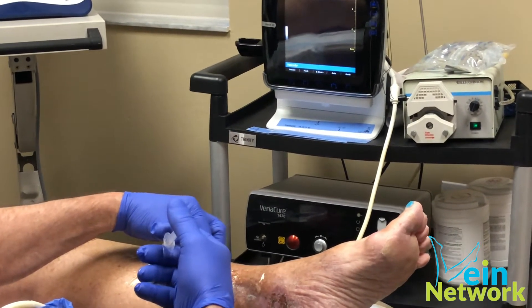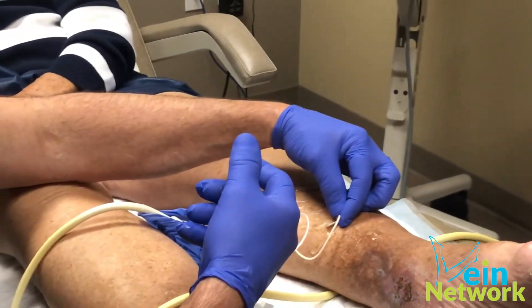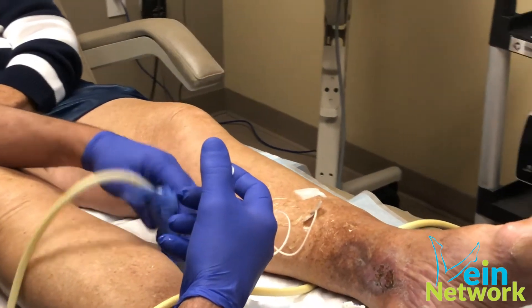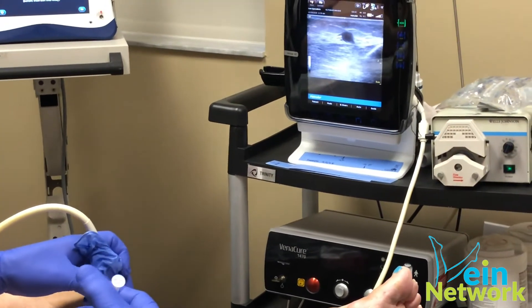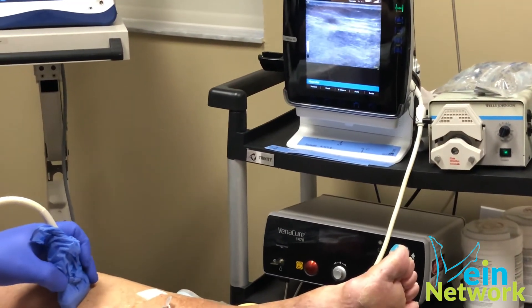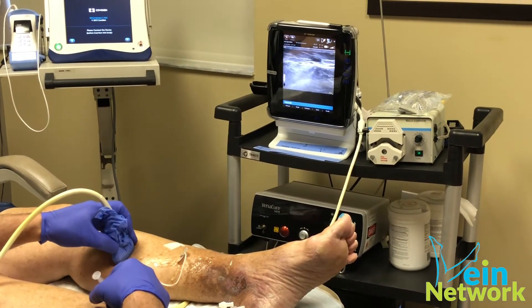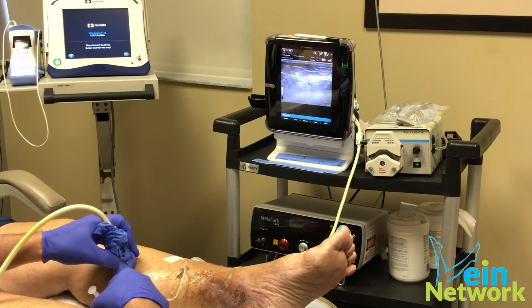I'm holding the needle in because the vein was kind of deep here and I was just barely in it. I'm going to see what it looks like now. Going a little higher here — you can see the vein go higher, and there's the branch.